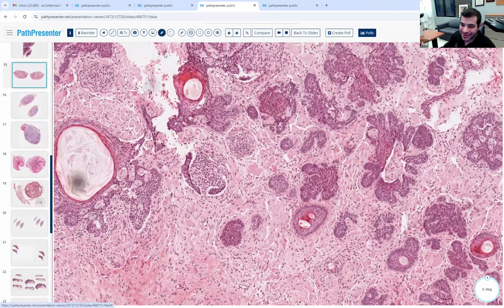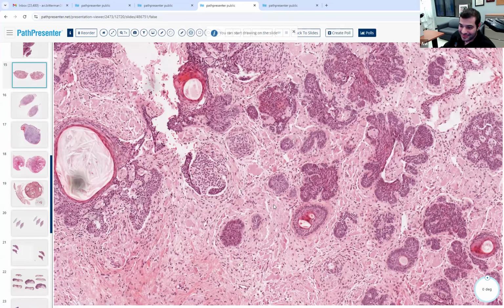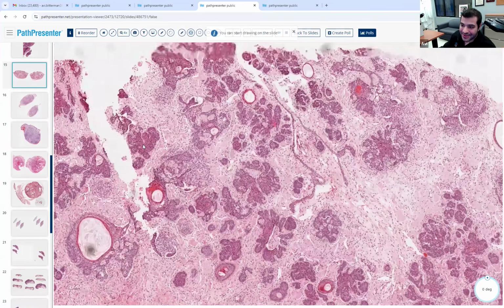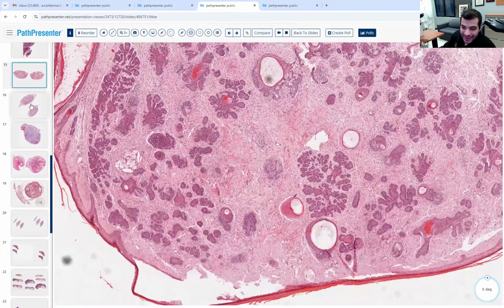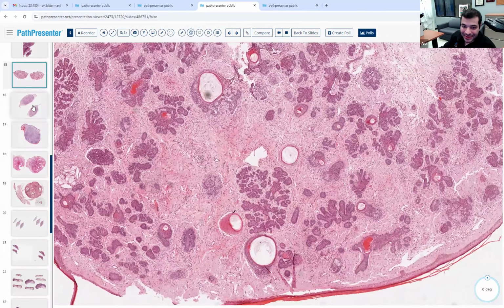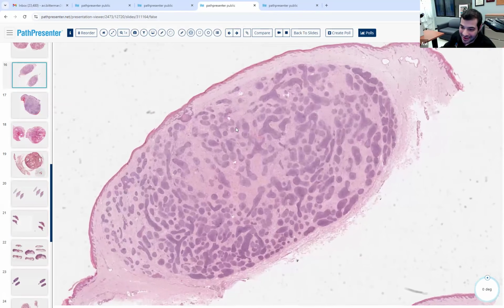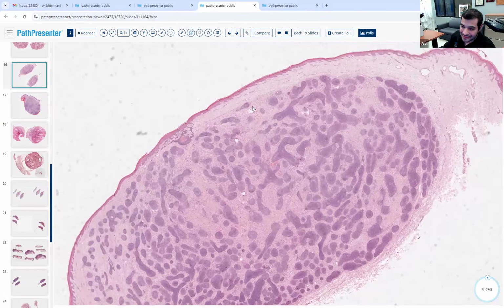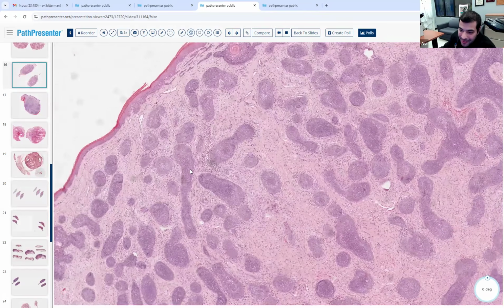What is this structure? A papillary mesenchymal body. See the ball and claw? So papillary mesenchymal bodies are another structure that go for trichoepithelioma. As opposed to this one, notice there's not as much keratinizing over here, and it's going deeper. Similar stroma though, right? What's the stroma on this one?